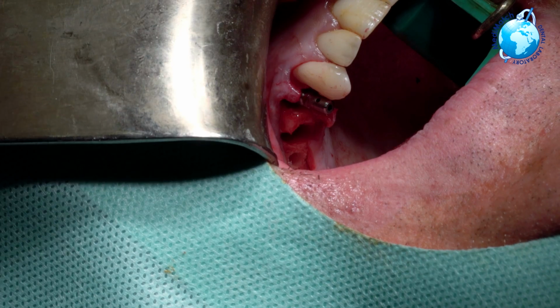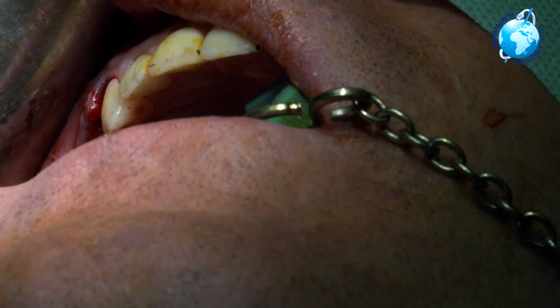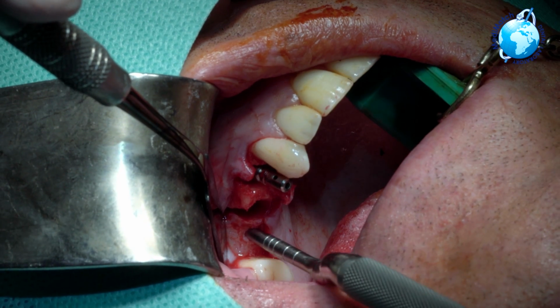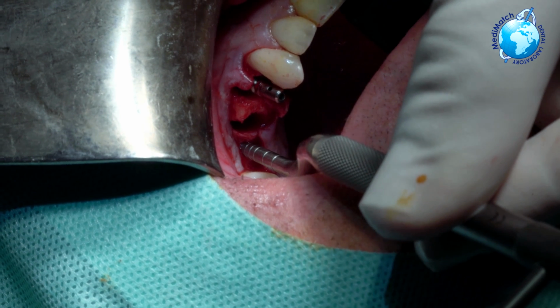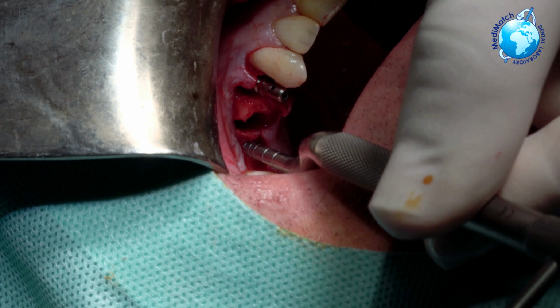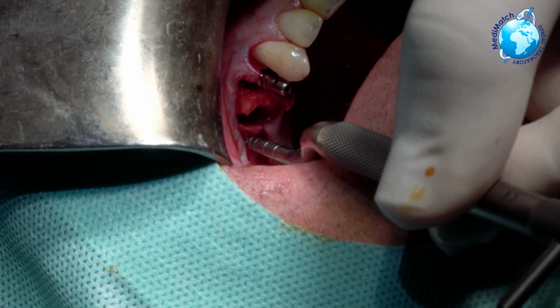So now we are sitting at the sinus floor, and we're going to do the rest of it with the osteotome. And we're going to punch up through into the sinus. Okay, Alan, a little bit of tapping, buddy. Yeah? Might feel weird. So we're condensing the bone, waiting for it to relax. Change of tone.